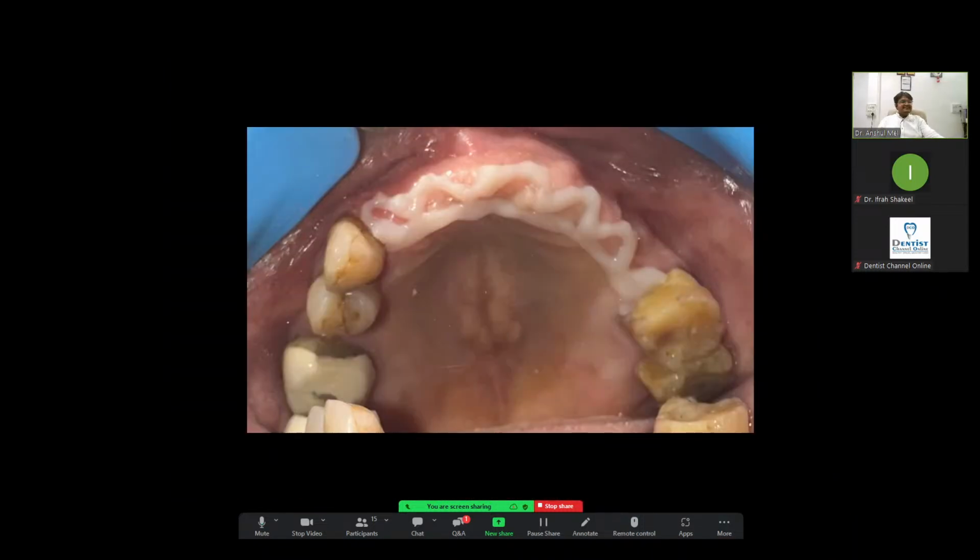This is a case in which we have a long edentulous area that we want to scan. At an earlier stage we used to place composite in this kind of area and then scan it, because the scanner will not stop when there is no static structure across a long scanning area. Nowadays we just put composite balls in between so it can be scanned easily. We mop the gums with a gauze piece so they become dry, then flow the flowable composite, cure it, and scan it.